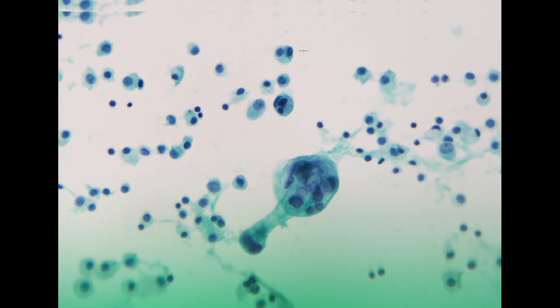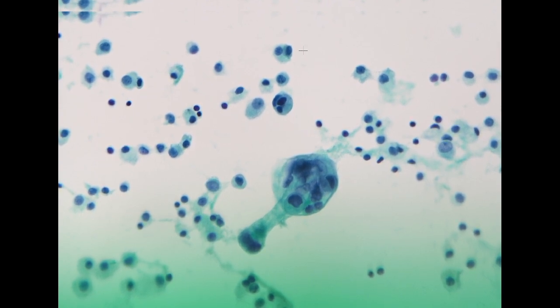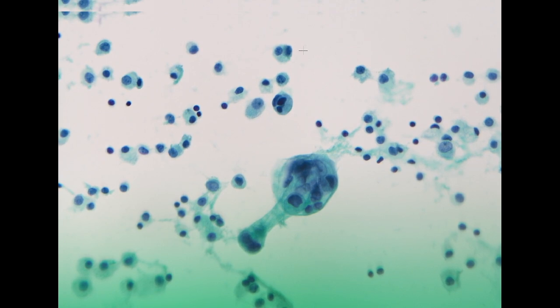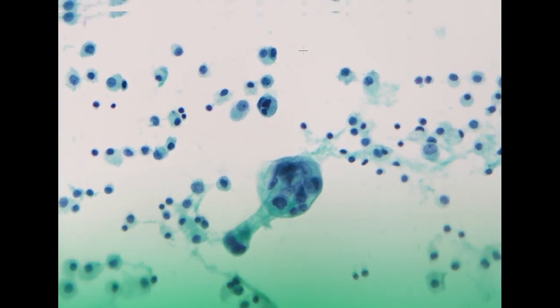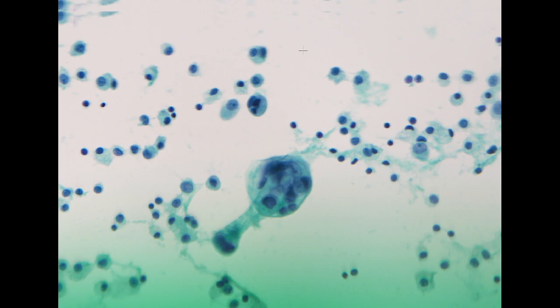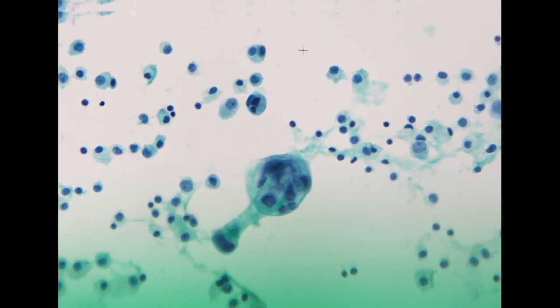Okay? So in this case, the patient actually does not have any history. He just came to our hospital for the survey of abdominal swelling, and they found ascites fluid. In this specimen, we actually received two different specimens from the same patient. The first specimen looks relatively normal, and for the second specimen, we only have one cluster of cells with a glandular arrangement.